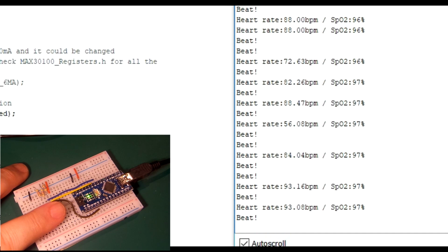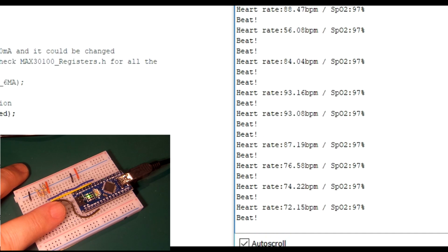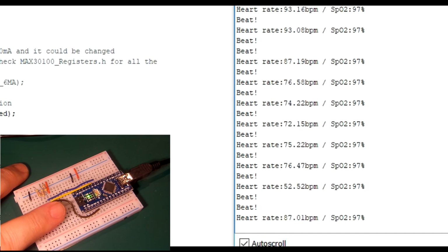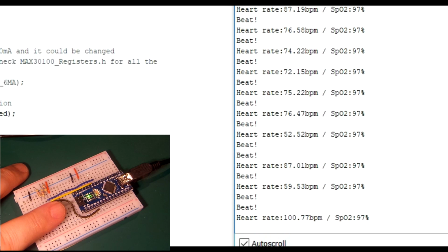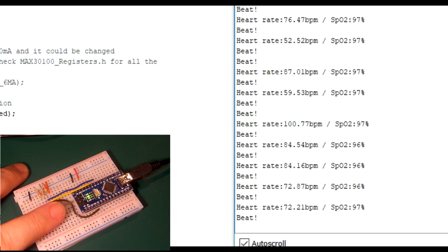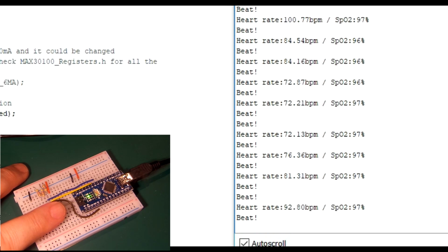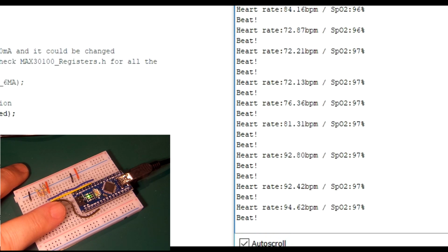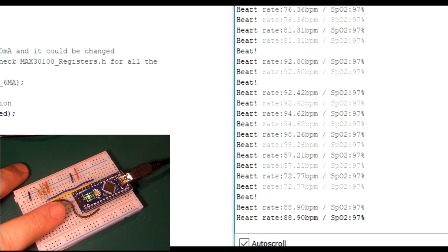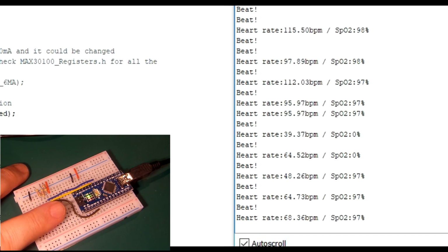Now, like the other sensor I've used for heartbeat, they can fluctuate a bit if you move your finger, but this one, although it might look like it's been a bit sensitive there, it is not as bad as the other sensor. So if I move my finger now, gently rock it, I am doing, but you can still see it's around about 70s and 80s. Whereas this amount of movement I'm doing now on the sensor would send the other one absolutely doolally.